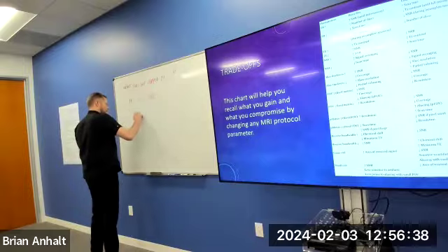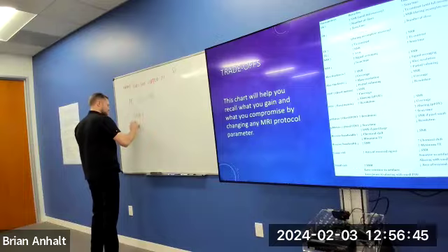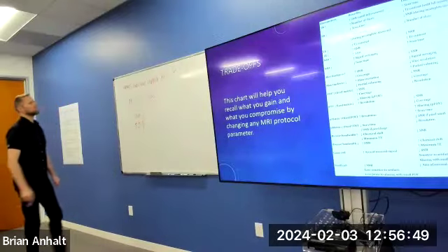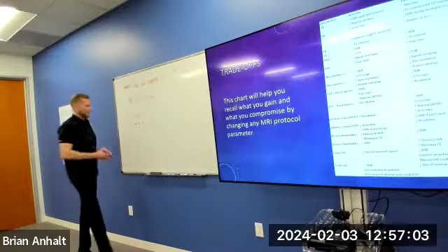SNR, I think I heard it all in there. SNR goes down, right? What else happens? T2 contrast goes up. Anything else? Anything happen to resolution? Anything happen to scan time? No. There are some other things we'll learn later, but this is all you need to know for now.